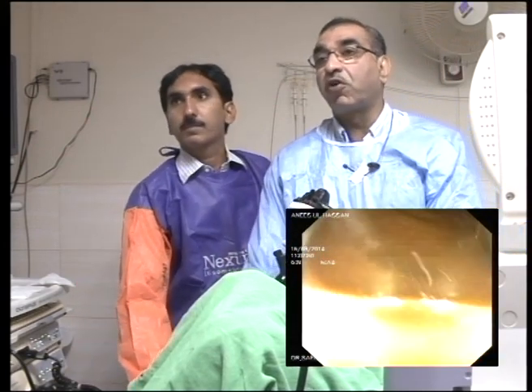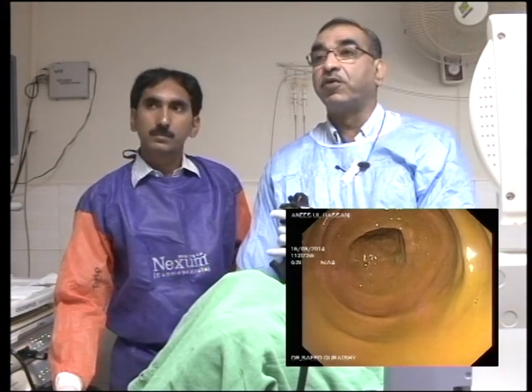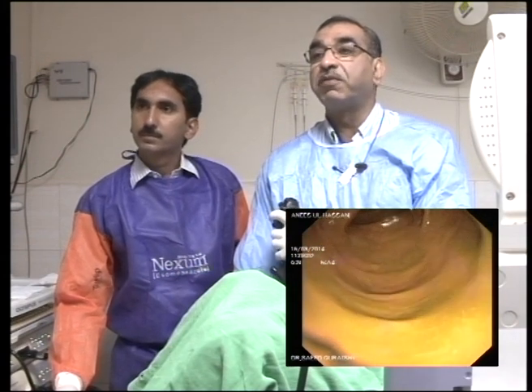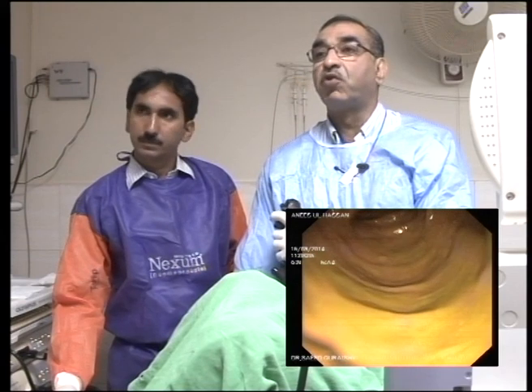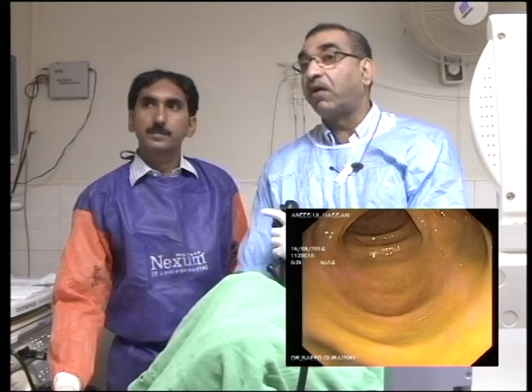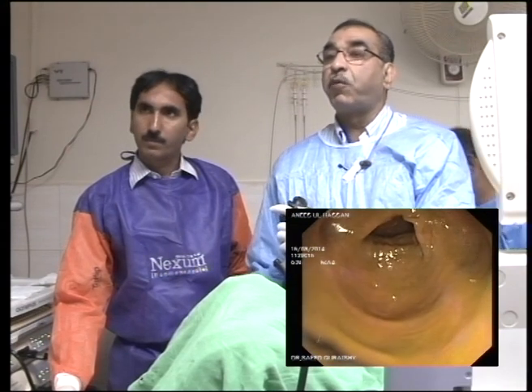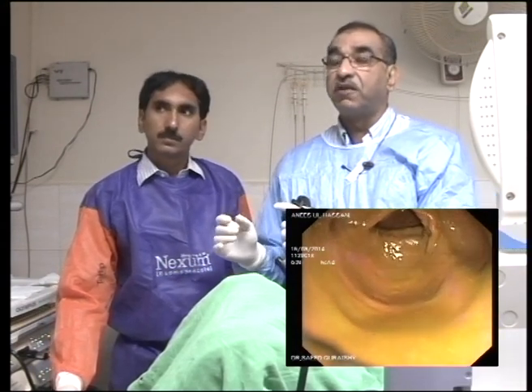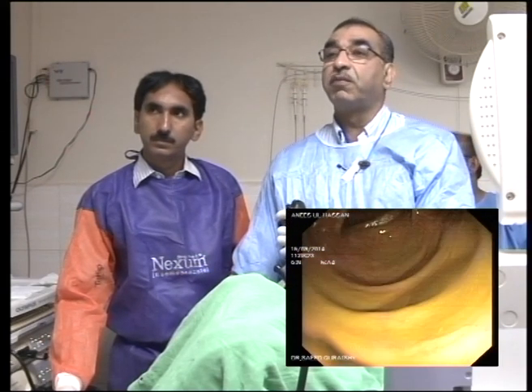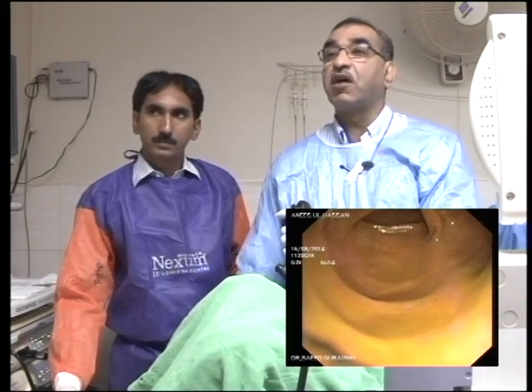The biopsy channel is at 5 o'clock position. So if you want to suck fluid, this is the way to do it. You bring the fluid at 5 o'clock position and you suck, just put the suction halfway down and you just slurp up the fluid gently without suctioning the mucosa or collapsing the lumen. Likewise, if you have a polyp or any lesion that you want to target or biopsy or snare, always bring that lesion at 5 o'clock position. Like I've again brought the fluid at 5 o'clock, because that's where your biopsy channel is, and that's where you can easily carry out the procedure.